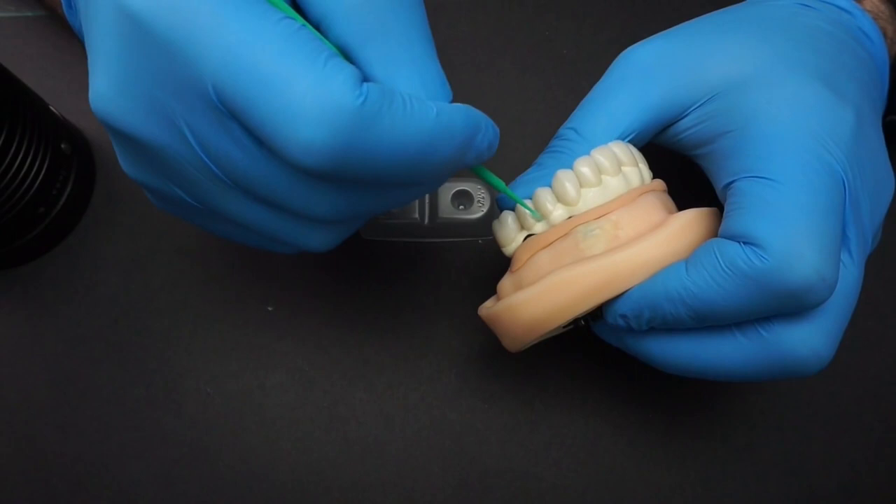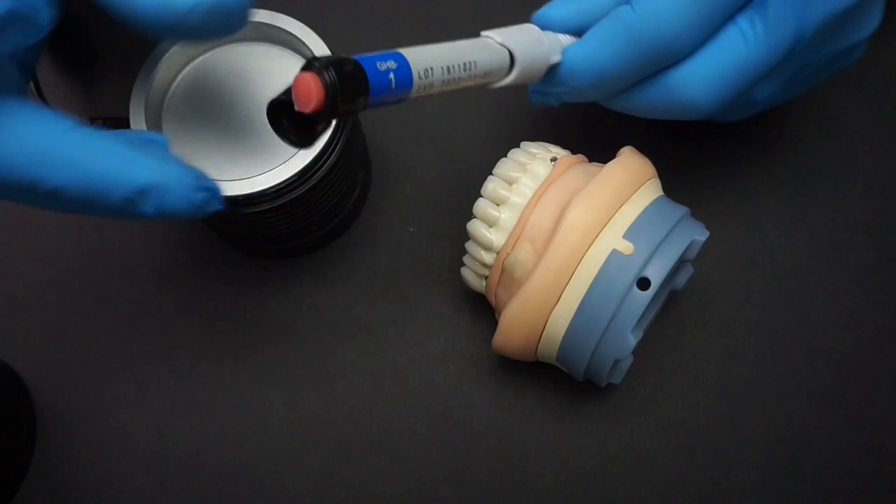After sufficient time has passed and the crowns are firmly cemented to your framework, it's time to prepare your framework for composite application. You can either roughen up the framework again or leave it as is. For the zirconia crowns, it's a good idea to have them glazed with a ceramic glaze because composite bonds much better to ceramic when using a micro-etching technique with a primer, rather than bonding directly to polished zirconia. I'm applying my multi-primer to all surfaces that will receive composite, making sure to be very thorough.